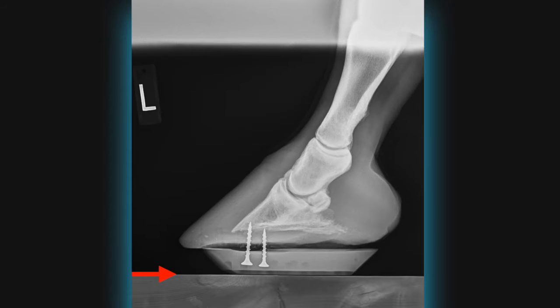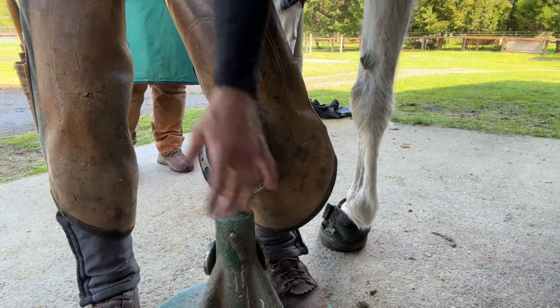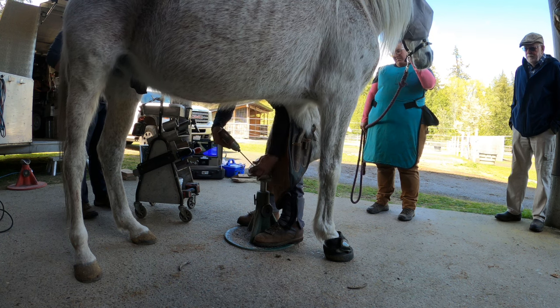This x-ray provides insight into the relationship between the breakover point of the urethane clog and the tip of the coffin bone. I'm also looking at the center of rotation and evaluating the widest part of the foot. The goal is to provide an equal load sharing from the center of rotation, and in this case, it's slightly forward, so adjustments will be made to the clog to make some improvements. There are other aspects of this x-ray that would be interesting to discuss, but we'll need to save for another time. Now I'm going to remove the temporary set screws so I can finish trimming this foot.